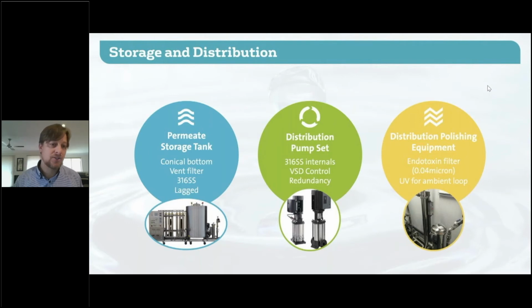So that storage tank has got to have a conical bottom so that you have no dead space at the bottom of the tank where water sits stagnant, which becomes a nice place for bacteria to sit and replicate. You need to have the tank sealed, but it still has to breathe as the water levels go up and down, so it needs to have a proper bacteria vent filter on it, so that as the air is introduced into the tank or expelled from the tank, you're not dragging in bacteria through that vent. And the tank needs to be made of an appropriate material that it can be disinfected appropriately.